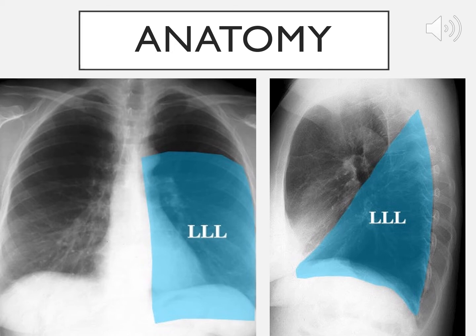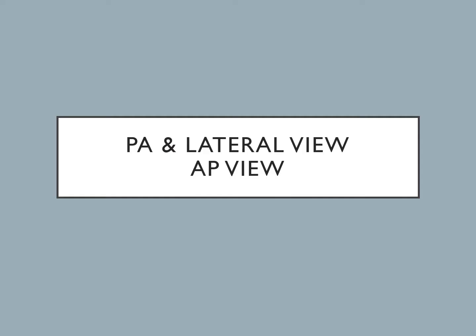Again, these are for review purposes. These are to sort of burn these images into our mind so that we know what we're looking at when we interpret these films.